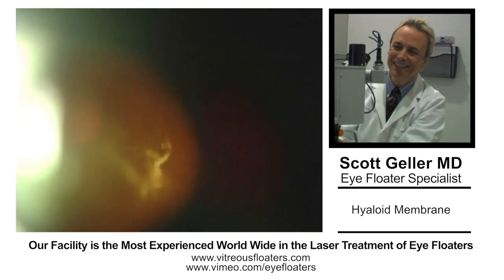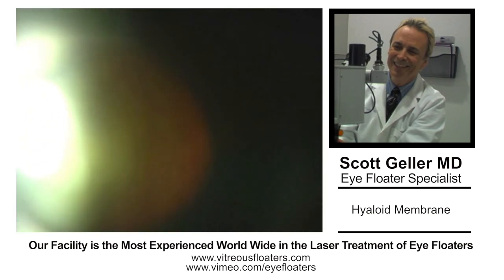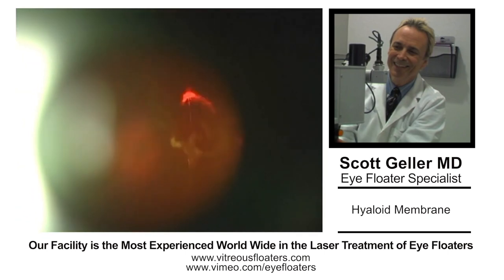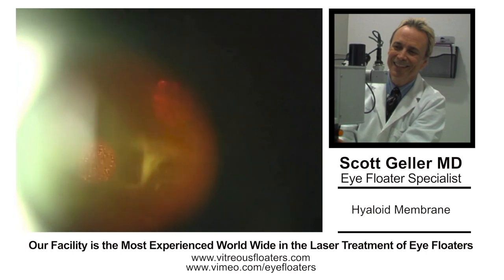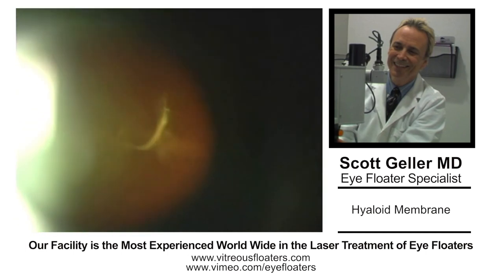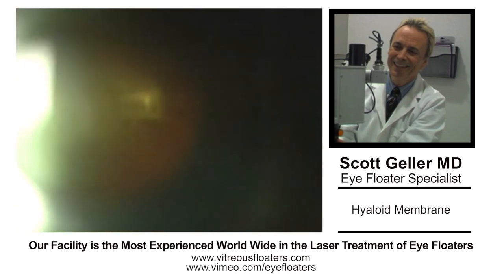This is a little more difficult than most ophthalmologists would think. It does take up to 4 sessions minimally — we know it did in this particular case — but the average case I've done takes 2 to 4 sessions. Any ophthalmologist who says this can be easily done in one session really doesn't have a good handle on it. There are a lot of colleagues out there who are a bit inexperienced because there are no good training facilities available for this.